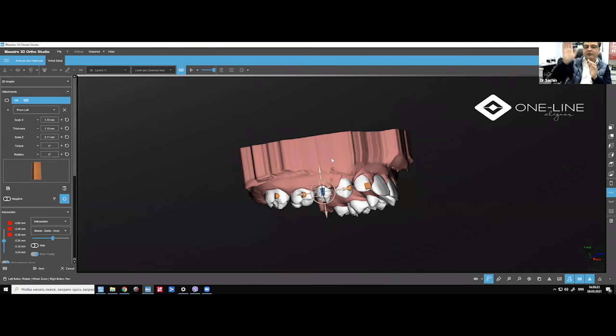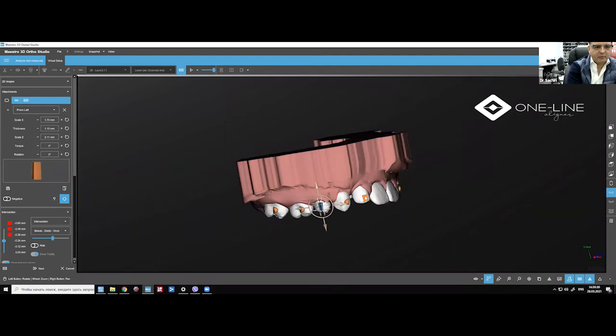What else do we do? For the tip, we also have three or four kinds of attachments, right? Let's say the same tooth. Sometimes you are replacing the attachments? Sometimes, not all the time. Normally what I do is I see the final outcome, and I use something which is in the middle.